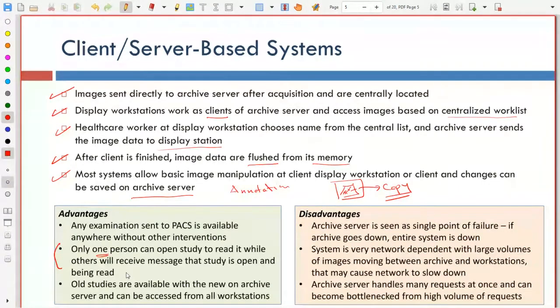This is very effective because, as I told you before, it's very important to divide the studies between the doctors in order to be able to finish all the cases. If you don't do that, you might end up with all the doctors working on one case, and then all the other cases are not diagnosed. So this is not the right way to do things.